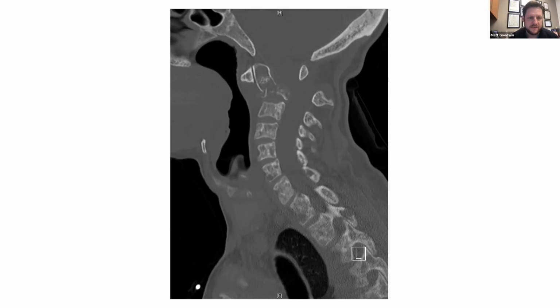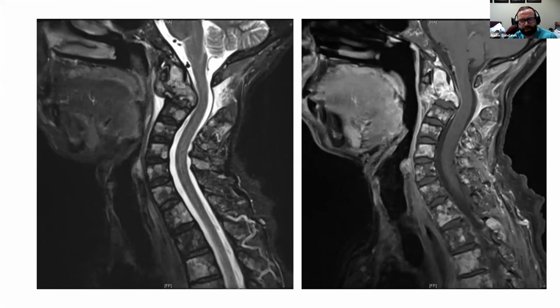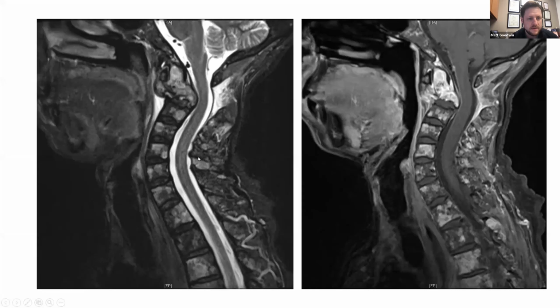Yeah, it's hard. Obviously, I'd get the rest of the workup we need in terms of plain films and having her stand and seeing what things look like. Get an MRI. So that's the MR. We can go back to this. Can we see that MR again, or you want to stay here for a second? Sure.